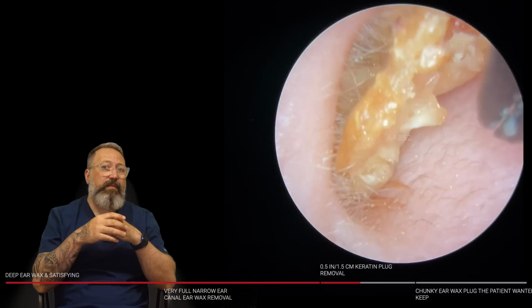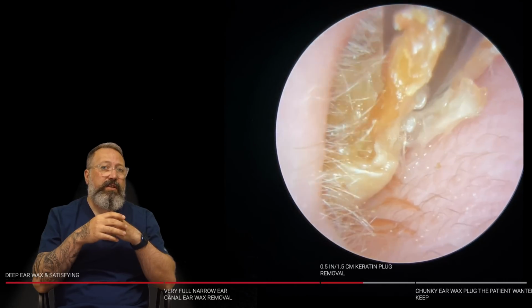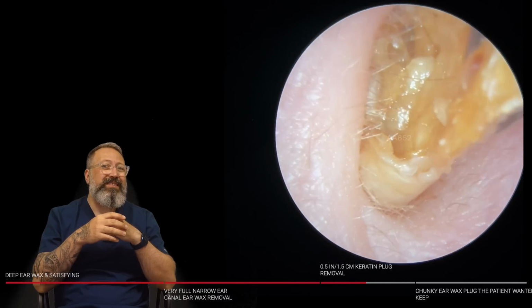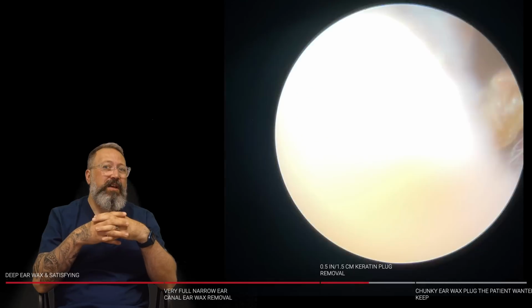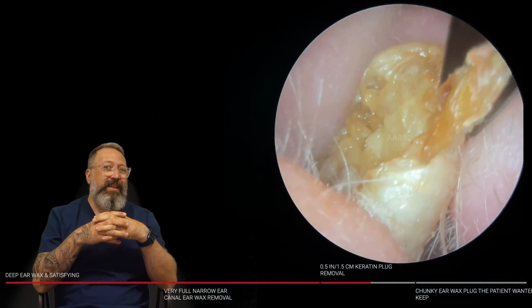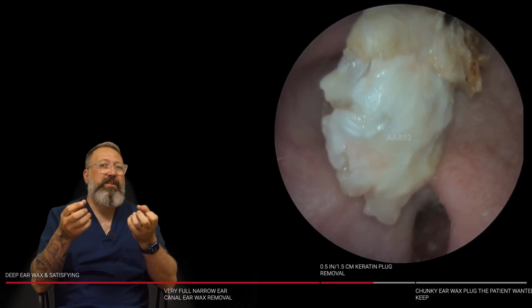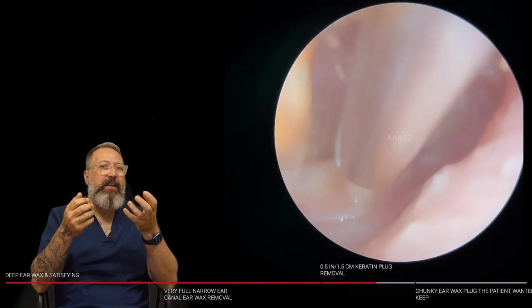There we go. Look at this come away now. This is just going to grab this. Watch this keratin plug. I will warn you, the inside of the ear canal does look quite messy afterwards because this has been sitting on the surface for ages. But look at that. Thick, and all that white material underneath is fresh, dead skin, basically, that can't get out. It's been adding to that keratin layer.